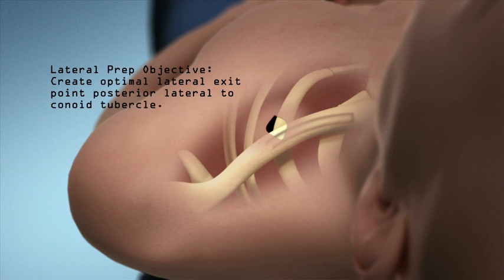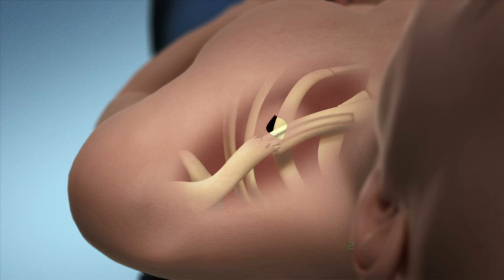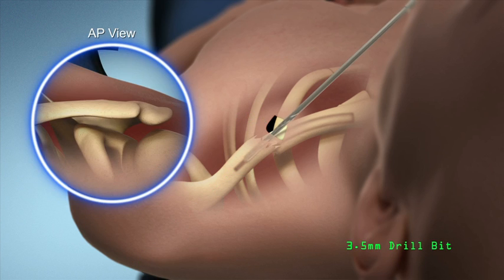Lateral prep objective. Create optimal lateral exit point by exiting posteriorly along the center line of the bone and lateral to the conoid tubercle. Elevate the lateral fragment and use the 2 millimeter drill to define trajectory to exit point. Use fluoroscopy to ensure the trajectory to the exit point is vertically in line with the coracoid process in the AP view, lateral to the conoid tubercle.